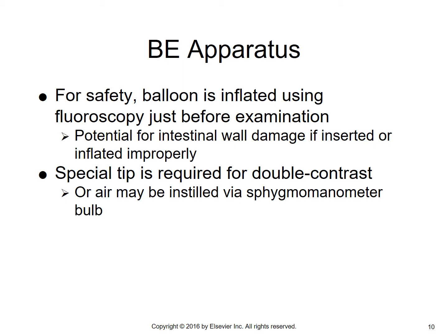Potential for intestinal wall damage if it's inserted or improperly inflated. So at many institutions, the tech is not responsible for inflating the balloon. It would be the radiologist's job, and as it says, it's usually done under fluoroscopic control. There are special tips that are required for double contrast studies, because you're going to have to be putting not only the barium in, but also the air as well.